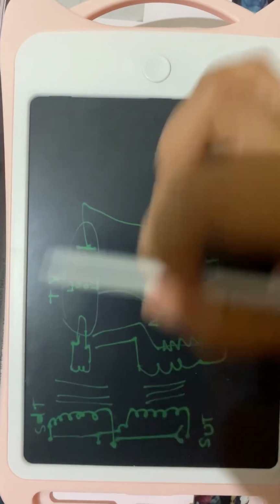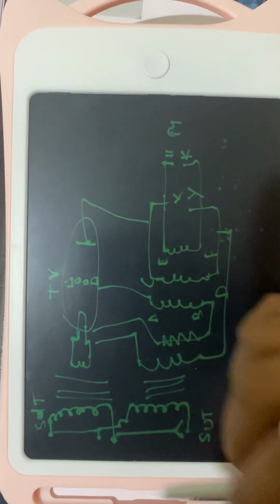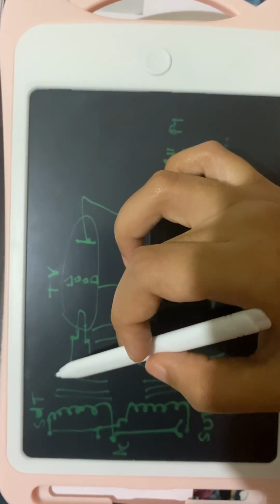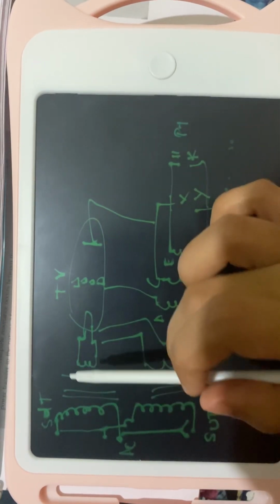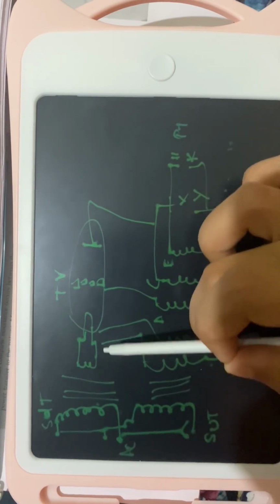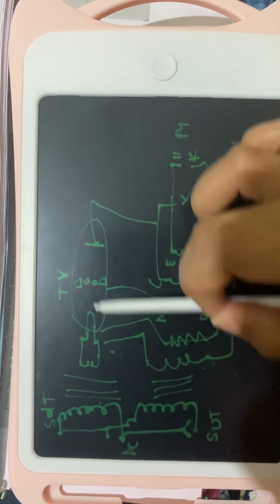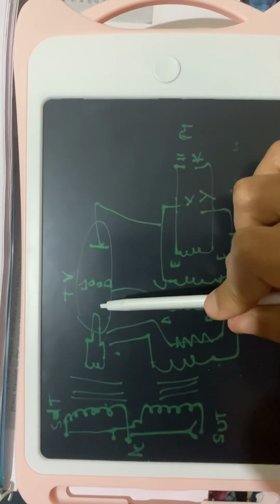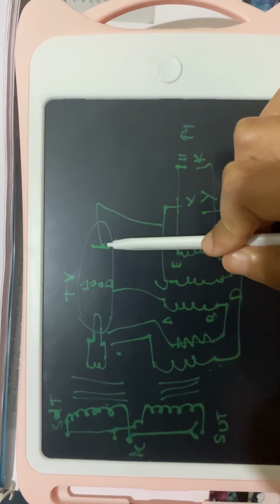of these circuits in shortwave diathermy. First, from the AC current source, current is passed through the step down and step up transformer. The current in the step down transformer is passed to the secondary coil. It's connected to the filament of the triode valve. The filament is heated, then it releases electrons. The electrons are then attracted towards the anode.